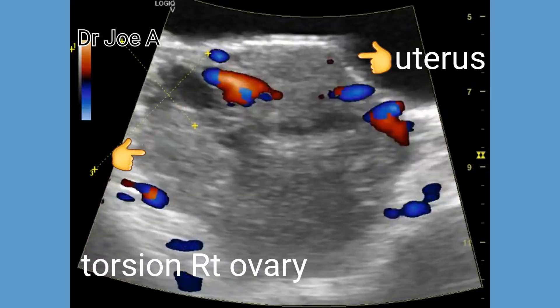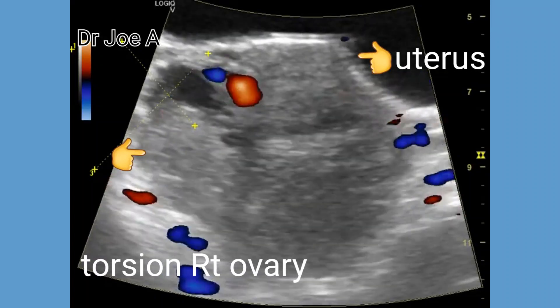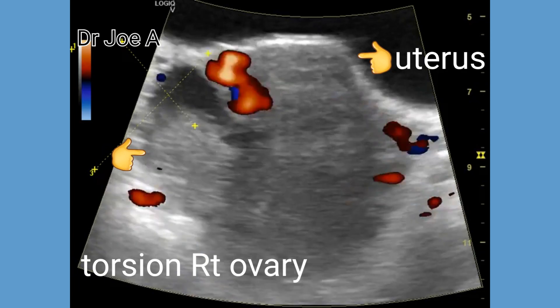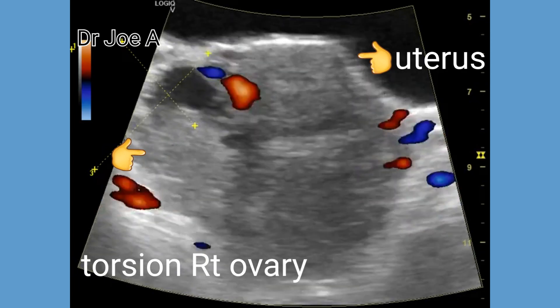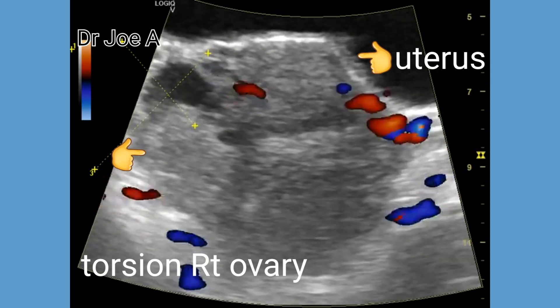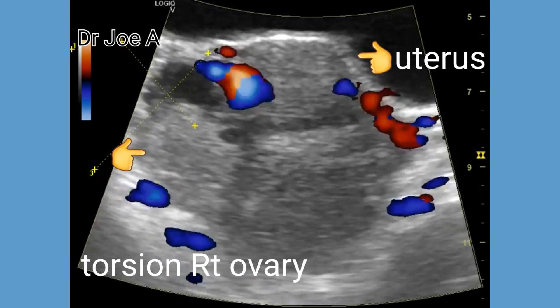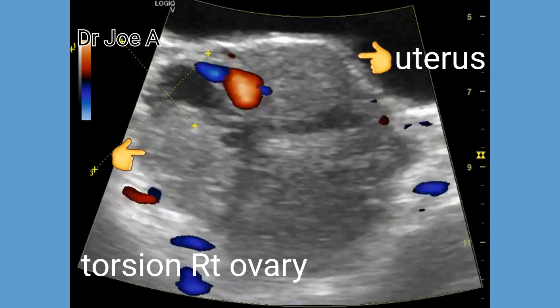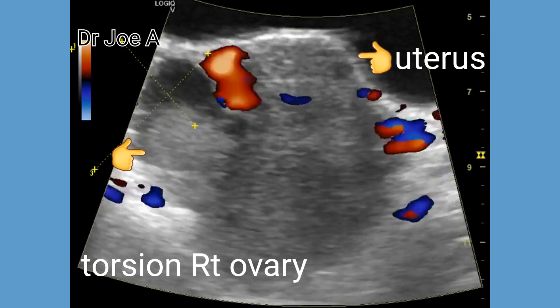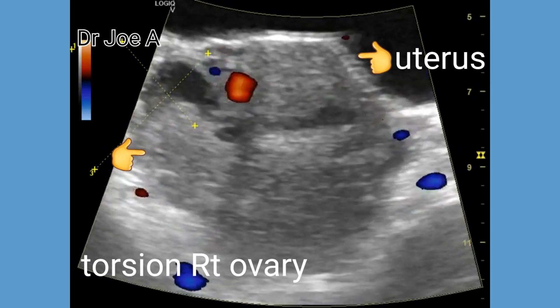This is a case of torsion of the right ovary, presenting as pain in the right hemipelvis. Transabdominal scan shows an avascular mass-like lesion posterior to the uterus.